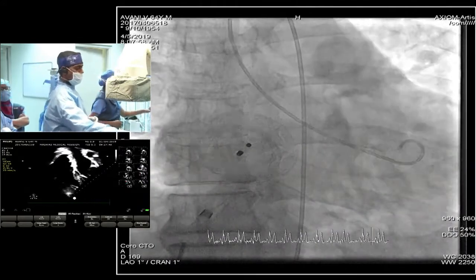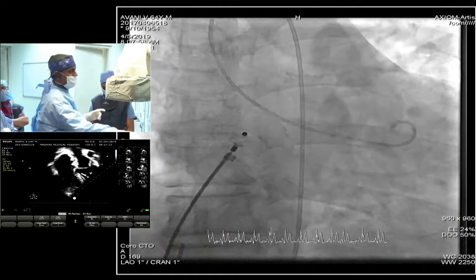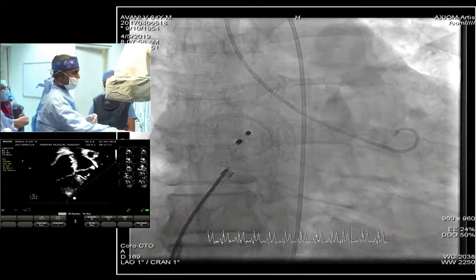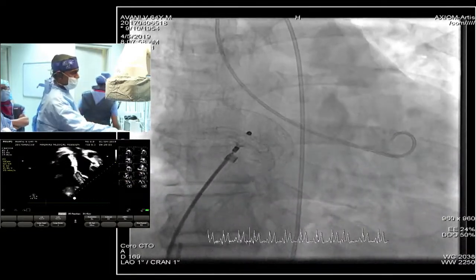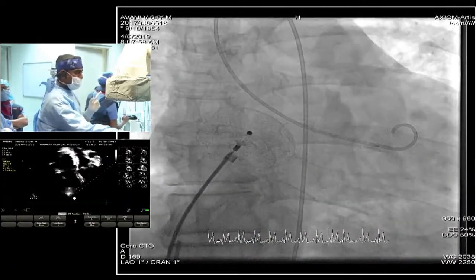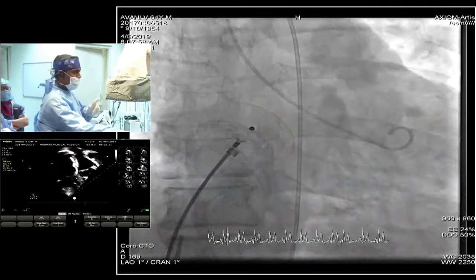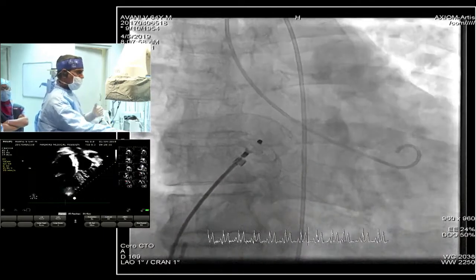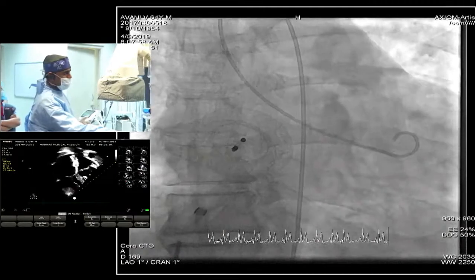We have published in Catheterization and Cardiovascular Interventions a paper on a snare assisted device. After putting in the Amplatzer device, we take a snare around the cable, hook the screw end of the Amplatzer device and then release the cable. The cable gives a perpendicular, right-angled, rigid orientation, whereas when you release the cable, the device flips out into the plane of the atrial septum, and during that moment, if there is a possibility of embolization, it's going to embolize.